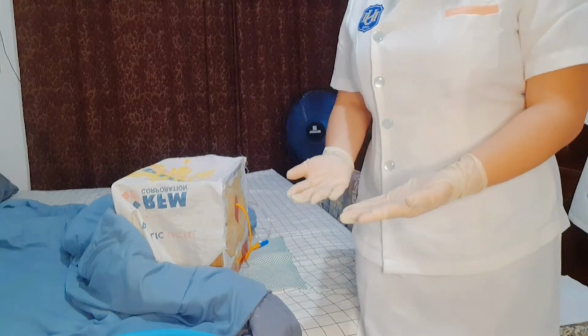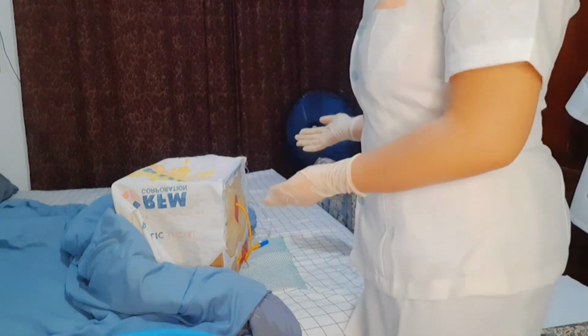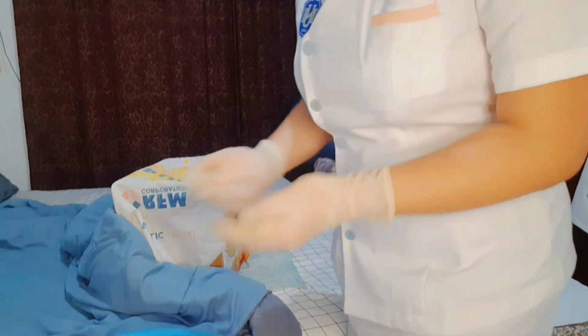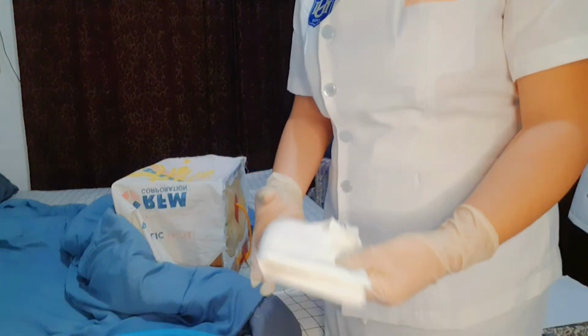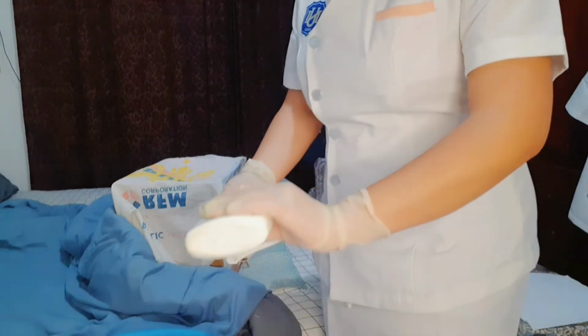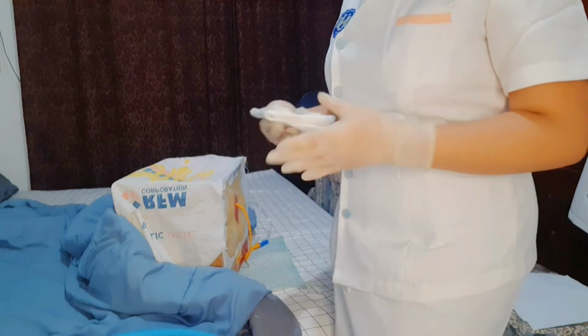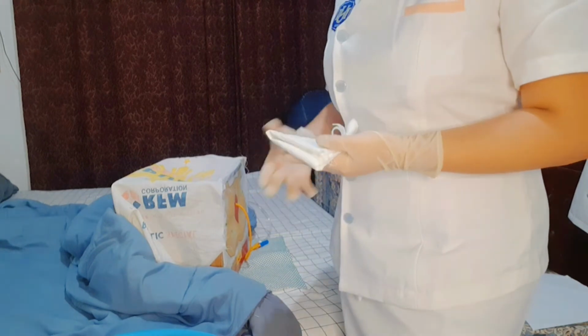So after you put the gloves, you need to clean the perineal area with soap and water. So I have here the water and also the cloth. I will press it on the water and then put some soap. The soap has antibacterial qualities adequate to clean the area, and it will not usually irritate the skin or mucous membrane.